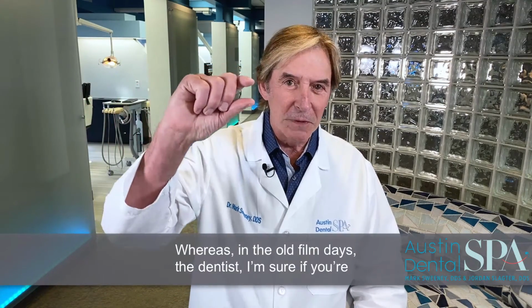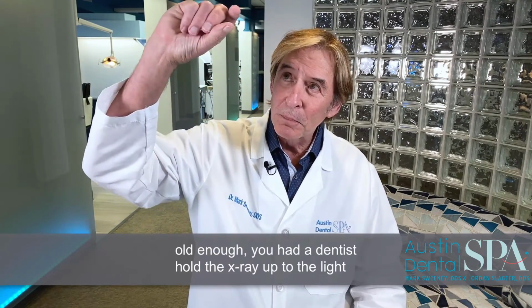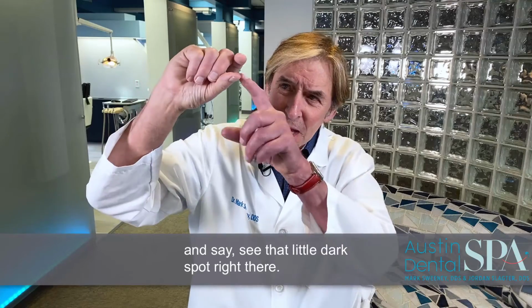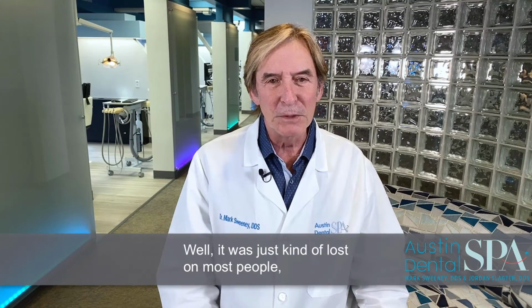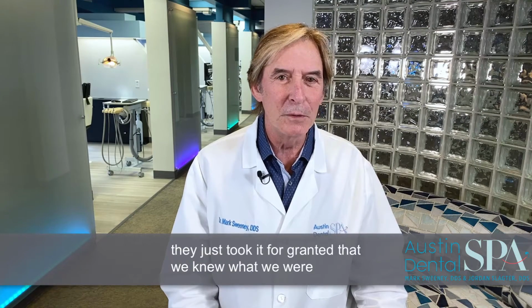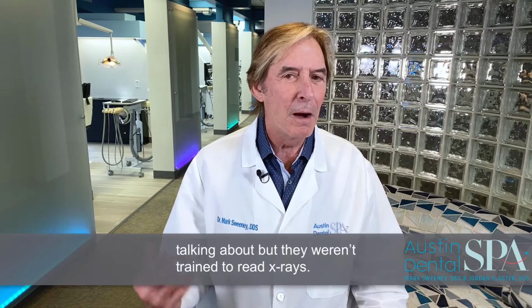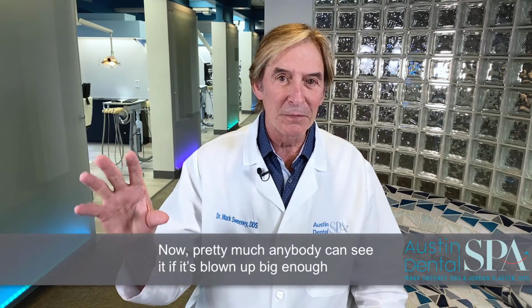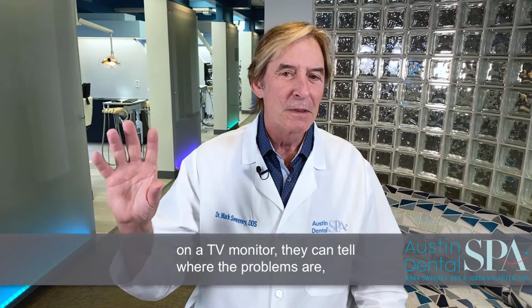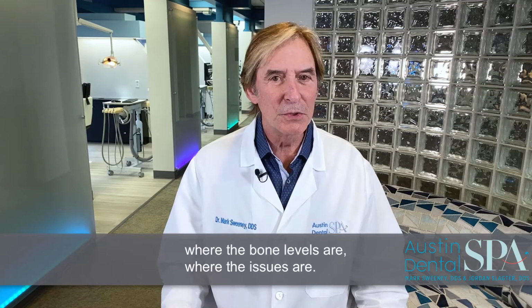whereas in the old film days, if you're old enough, you had a dentist hold up the x-ray up to the light and say, see that little dark spot right there? Well, it was just kind of lost on most people. They just took it for granted that we knew what we were talking about, but they weren't trained to read x-rays. Now, pretty much anybody can see it if it's blown up big enough on a TV monitor. They can tell where the problems are, where the bone levels are, where the issues are.